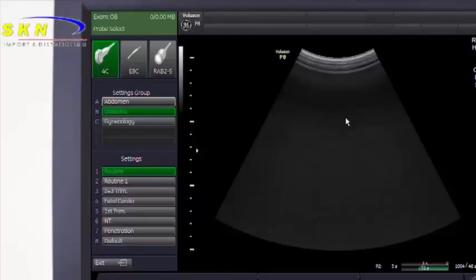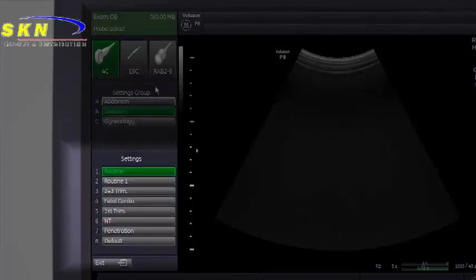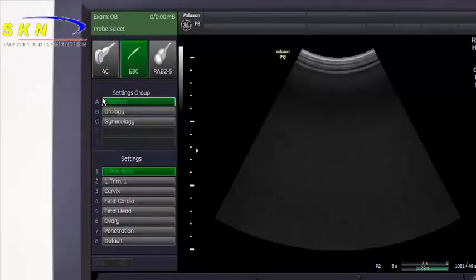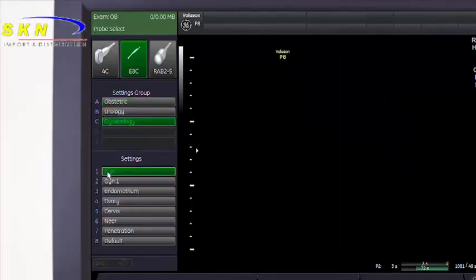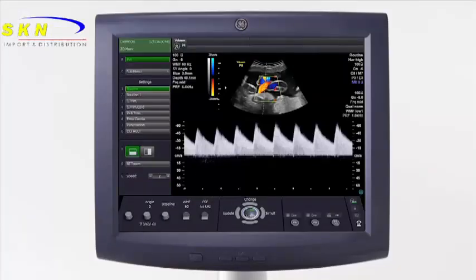Choose a probe by selecting the probe hard key. Once probe selection is complete, select the settings group or application and the applicable setting or preset. The menu is dynamic — when you change a probe, applications associated with that probe are displayed. Once an application is selected, settings associated with that application are displayed. System presets are optimized for the specific study to be performed in B mode, color, and Doppler.